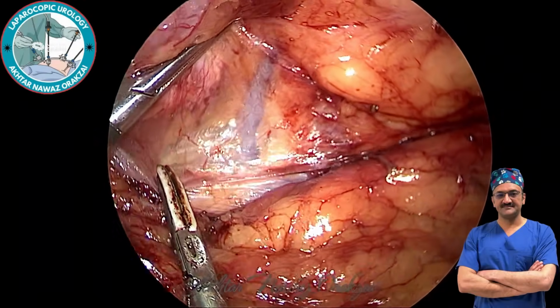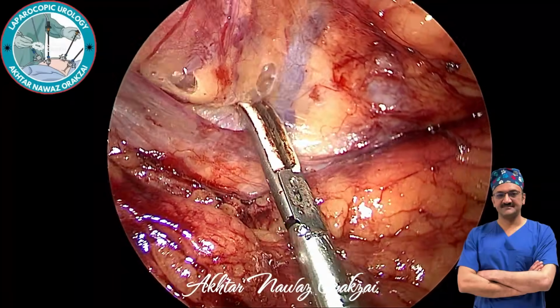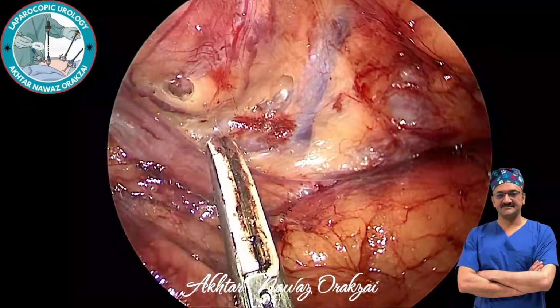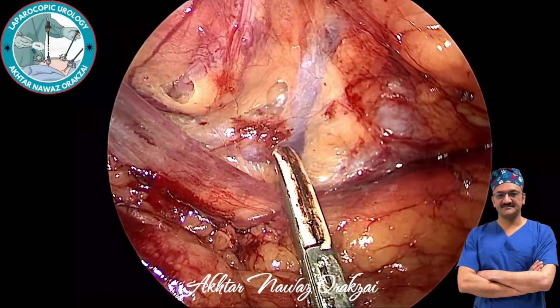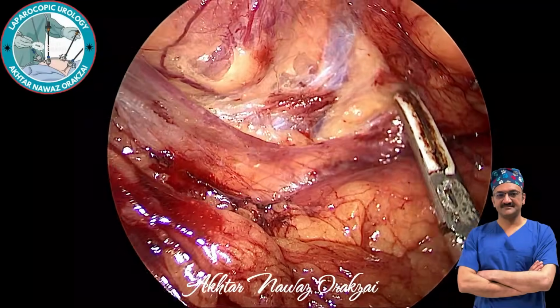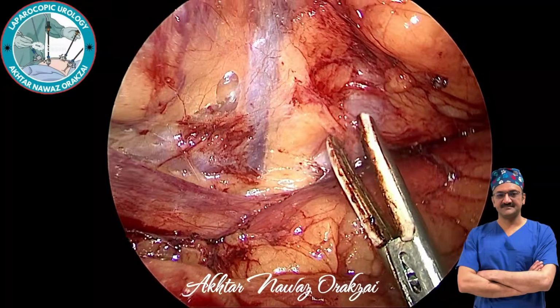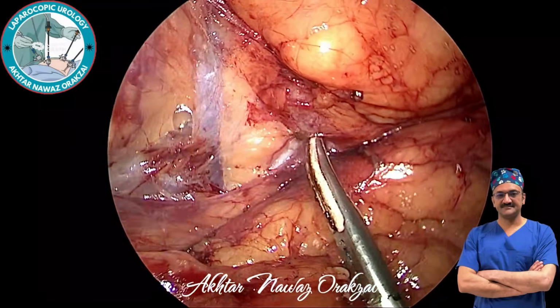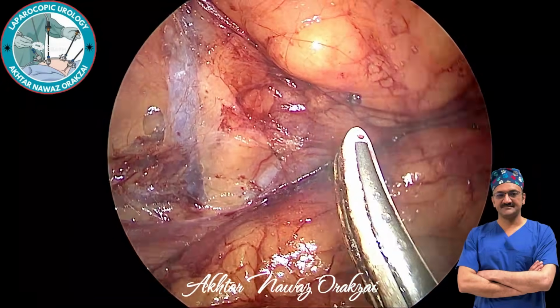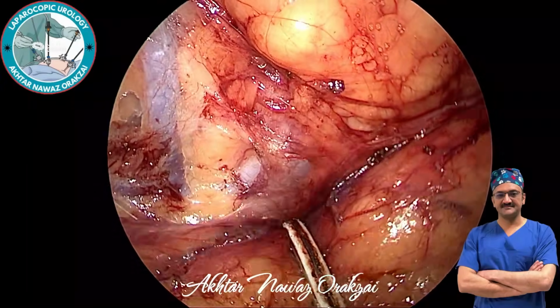This video is about the left-sided laparoscopic adrenalectomy for a 6.5 centimeter mass in the left adrenal. So the basic steps are mobilization of the colon, and then identification of the gonadal vein, and then following the gonadal vein, this will lead you to the renal vein, and that will lead you to the adrenal vein.